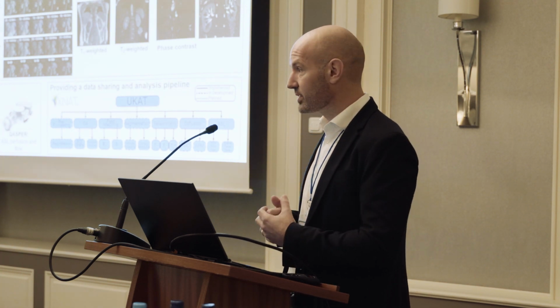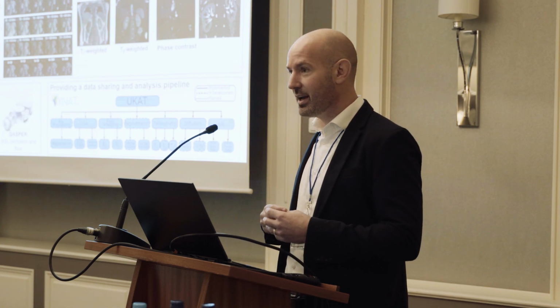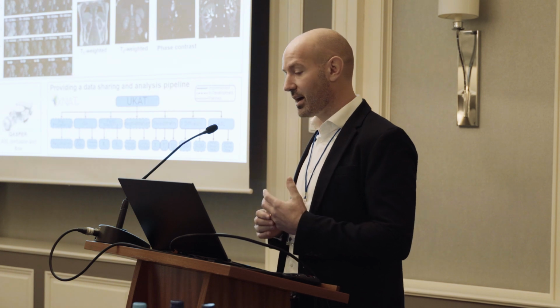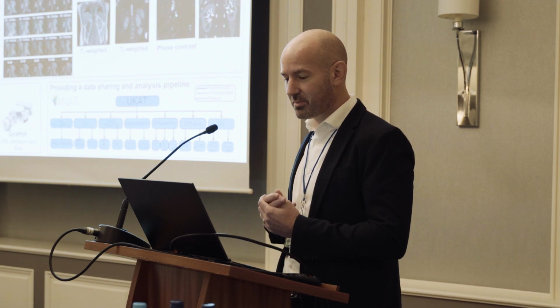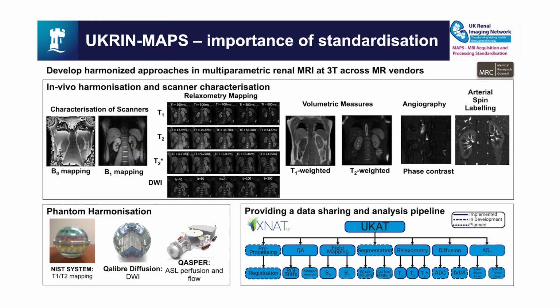so scanner manufacturers, for example, because there's a huge amount of work, as summarized on this slide, that's needed to standardize different imaging measures, particularly when we're talking about quantitative measures. This is work led by Sue Francis in the UK, harmonizing the different MR measures across different sites, and importantly, across the 3 major scanner manufacturers, Philips, GE, and Siemens. So if you take an MR in one place, you're going to have the same results from a different MR scanner at a different place.